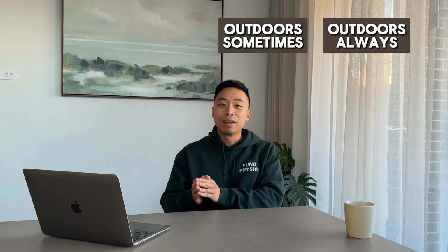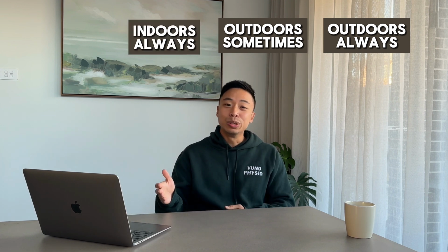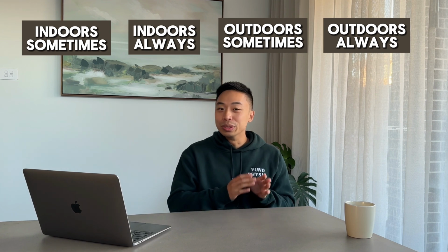Some people need to use it every time they're indoors, but not outdoors. There's some people who only need to use it indoors sometimes, on days where they're feeling terrible, or only in the mornings when they're feeling really stiff. If you want to play it safe, you can just always use it everywhere.